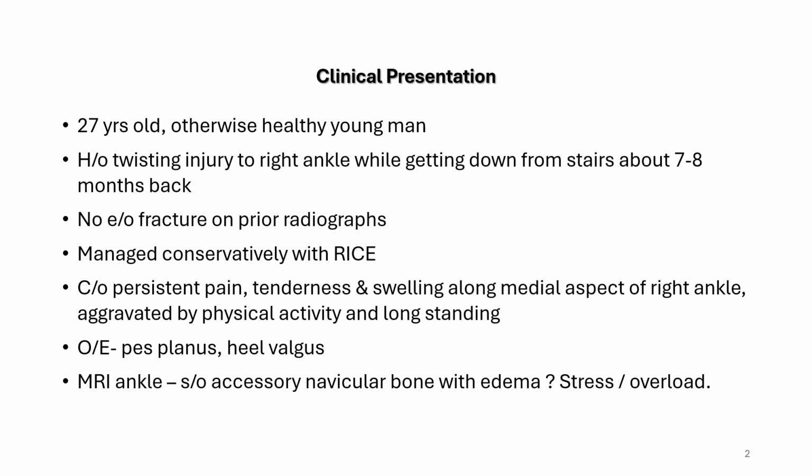This was a 27-year-old, otherwise healthy young man who presented with a history of twisting injury to the right ankle while getting down from the stairs about 7 to 8 months back. There was no evidence of fracture on prior radiographs. He was managed conservatively. However, he presented with persistent pain, tenderness and swelling along the medial aspect of the right ankle, which was aggravated by physical activity and long standing.